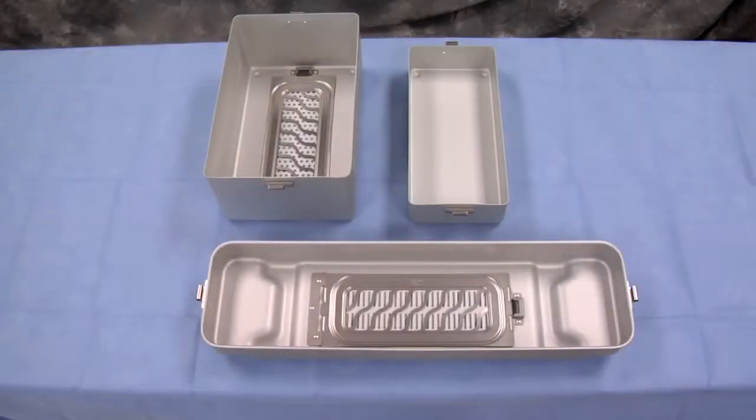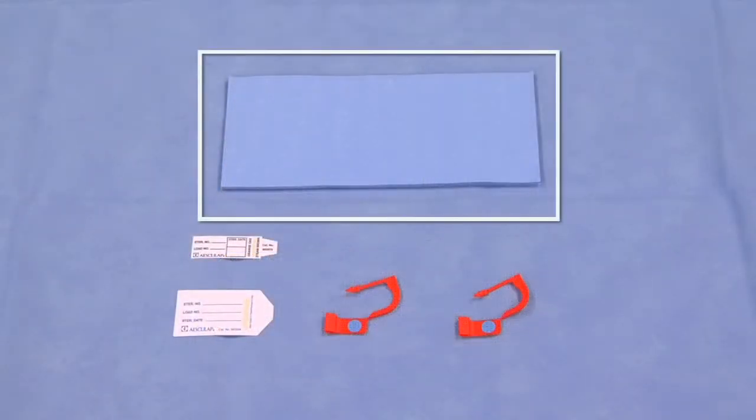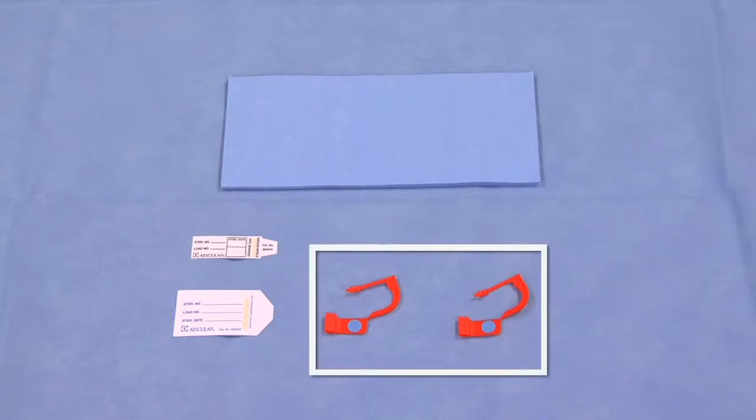Esculap's sterile container system is comprised of the following components: container bottom, container lid, container basket, and processing supplies such as filters, indicator cards, and tamper-proof locks.